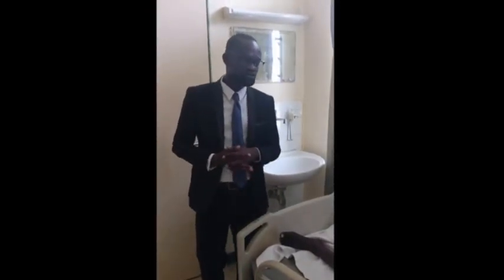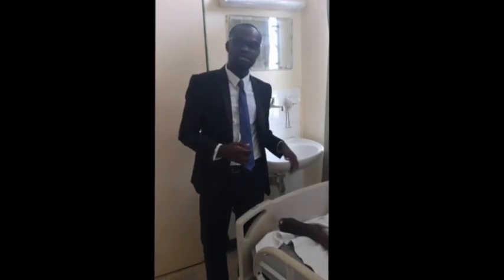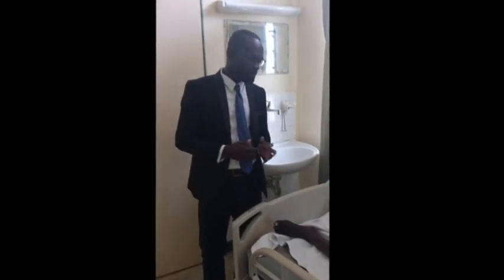There are also several contraindications why you shouldn't apply anti-embolic stockings to the patient. Some of them include when the patient has obvious peripheral arterial disease, the legs are pulseless, they are pale, you shouldn't apply anti-embolic stockings. Also, when the patient has severe peripheral neuropathy, especially in patients with diabetes mellitus. Other contraindications include when the patient has severe leg deformities, also when the patient has undergone a recent skin grafting.